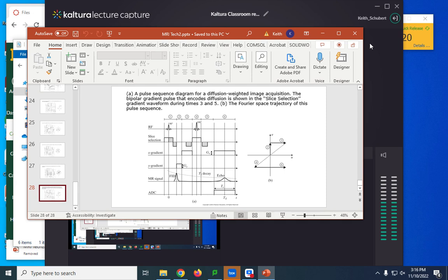And we can test them and see what we can get done on his for the contrast. Usually it's a very small, he has some MRI phantoms that he uses to calibrate. So that'll be the basic imaging one we'll do. We might actually try to take one of the ones that we did the ultrasound, and see if those can give a response. It'd be nice to have both an ultrasound and MRI, and then near infrared spectroscopy.